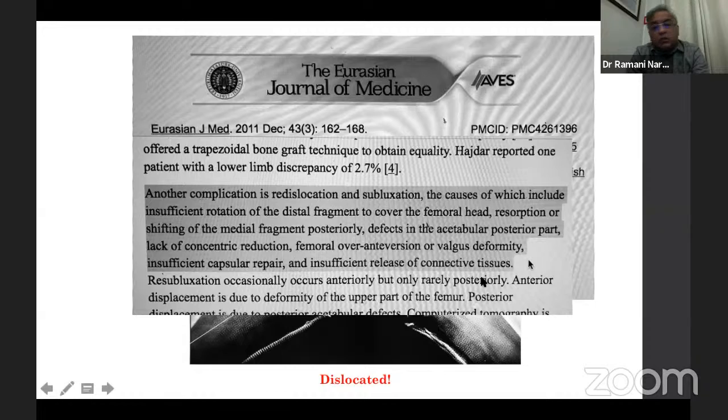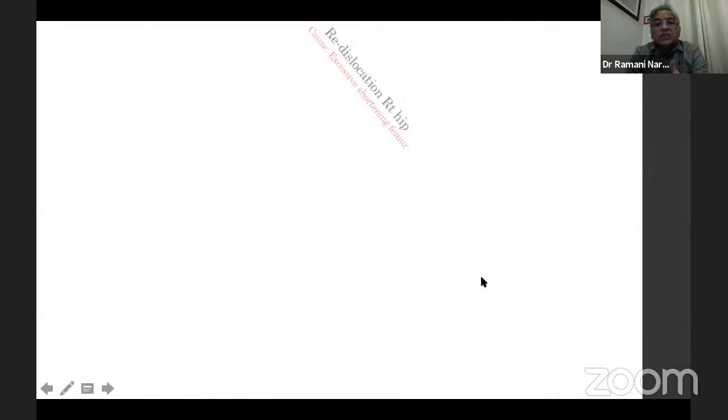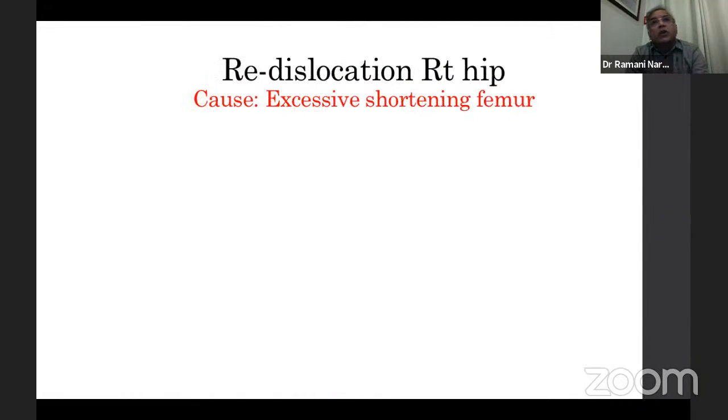But what they didn't talk about, and what I think was the reason, was excessive shortening of the femur. That's what I think I did. Because the hip was very easily going. There was no tissue tension. So the right side I did first. This is an earlier case, early 2000. And I think I over-shortened the femur.